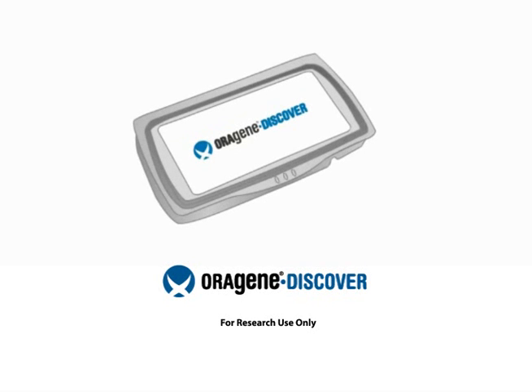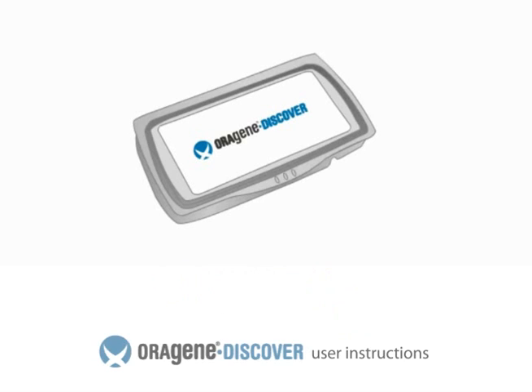The Oragene Discover self-collection kit is proven for the collection, stabilization, and transportation of DNA samples from saliva.